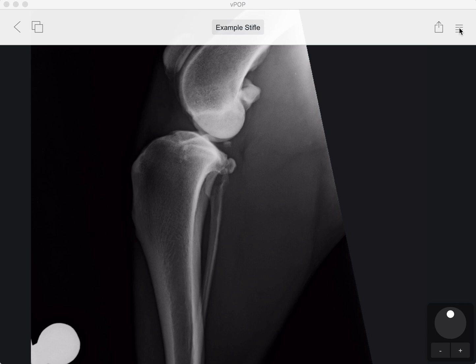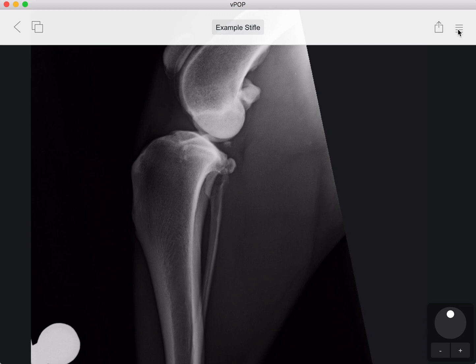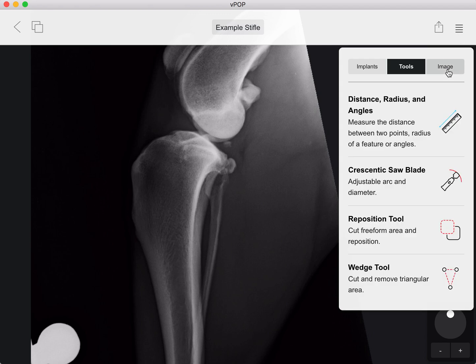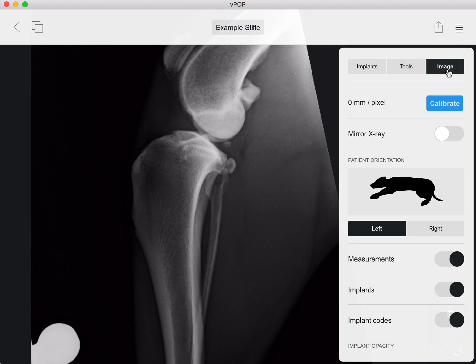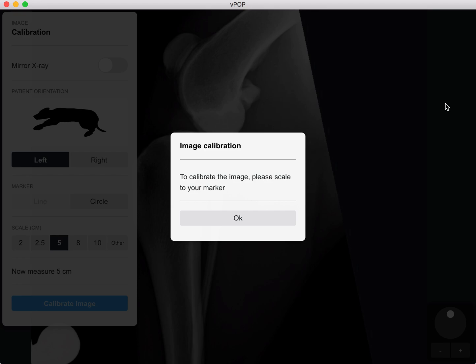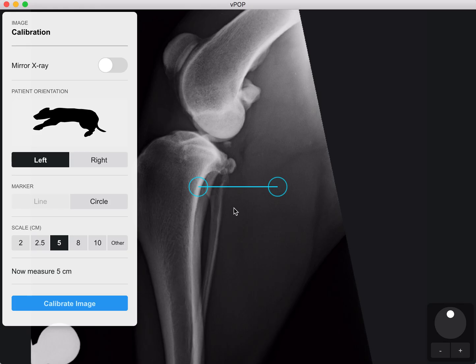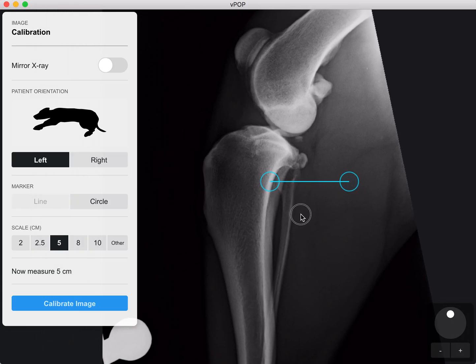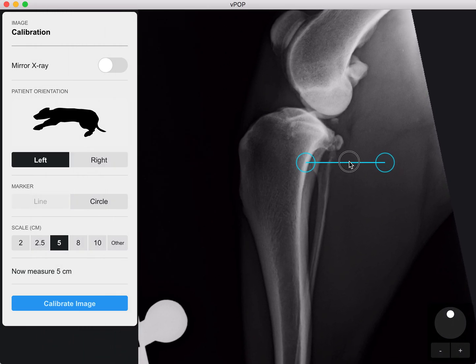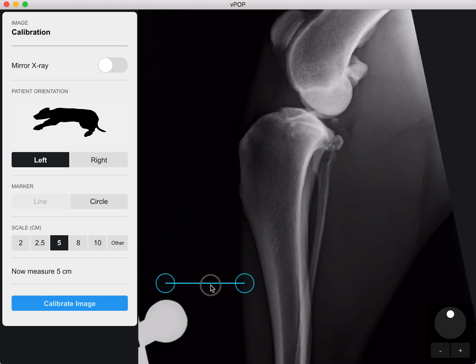So the first thing we're going to do is calibrate our radiograph. We're going to go to menu in the top right, click and look for image, and the first message that you'll get when you import your radiograph is this. You've got to calibrate it, so click OK and now we're going to move our line to our radiographic marker.